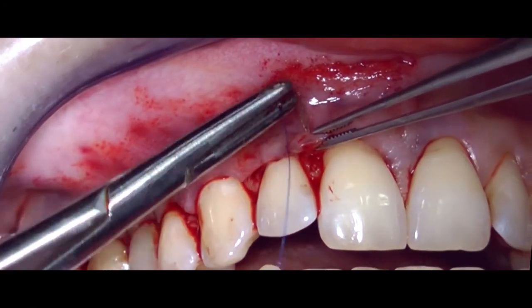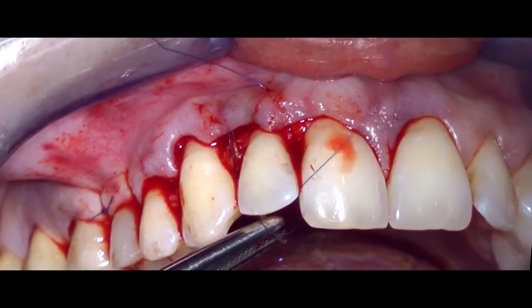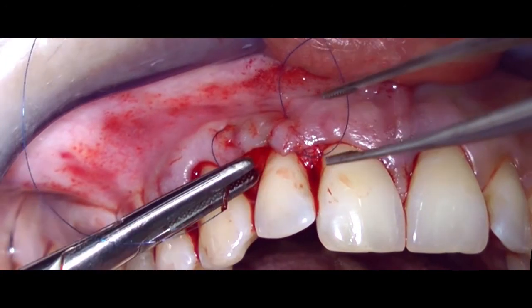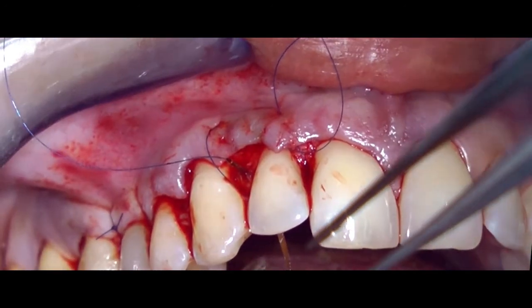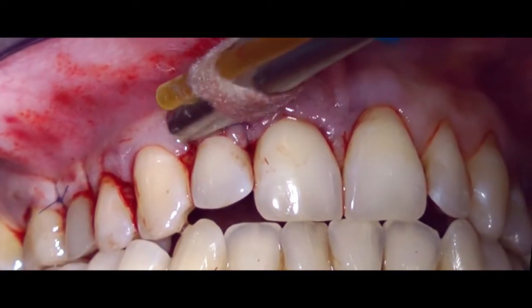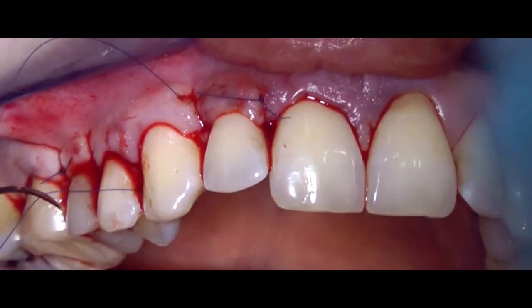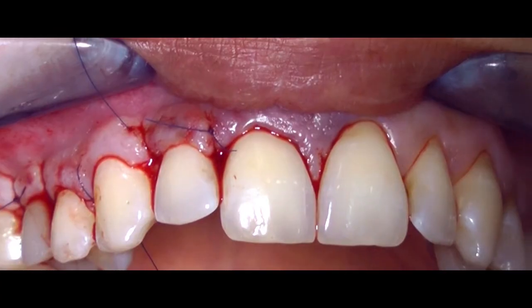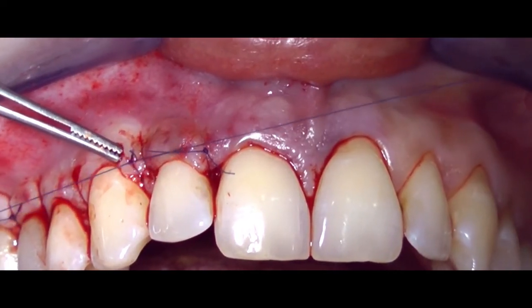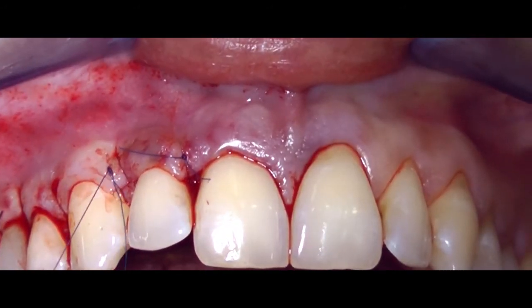The next area to be sutured is the mesial area, and we will be changing between distal and mesial areas until the final sutures on the central area, which is the area that undergoes the greater advancement. We can see that this suturing technique allows for an interesting adaptation of the marginal tissue to the root recession, allowing for clot stabilization.